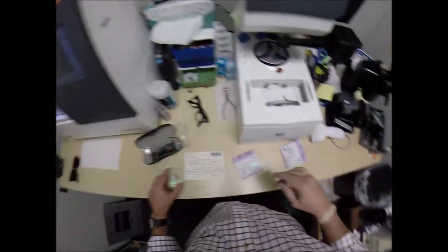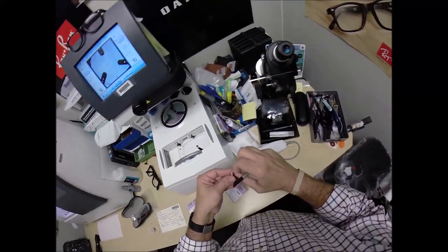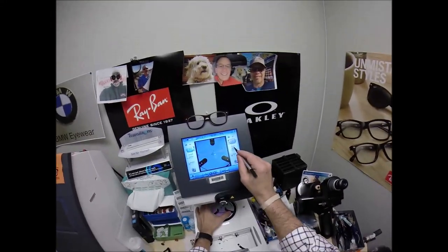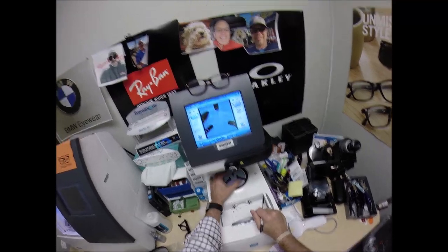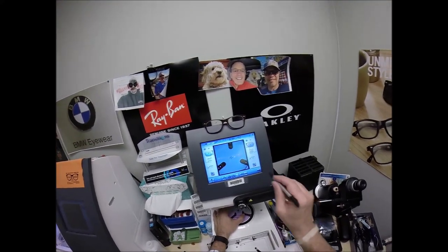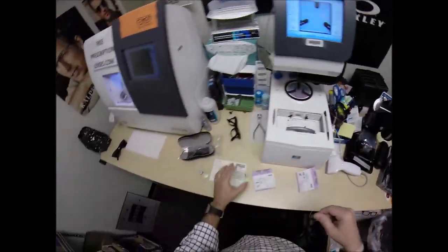We're going to do the same thing for the left lens. Line up the magnet — same pupillary distance, same optical center height — get everything lined up perfectly, and hit that button. The arm's going to come down and place the block onto the left lens.